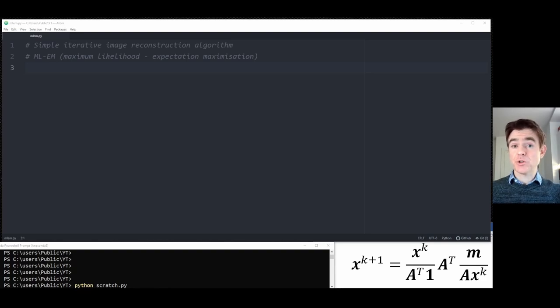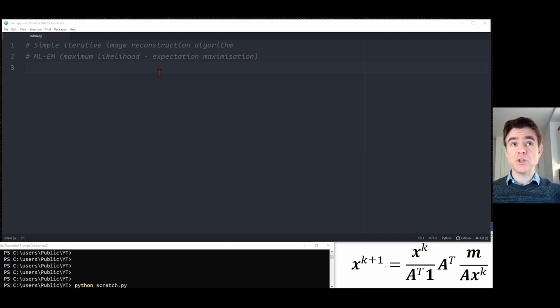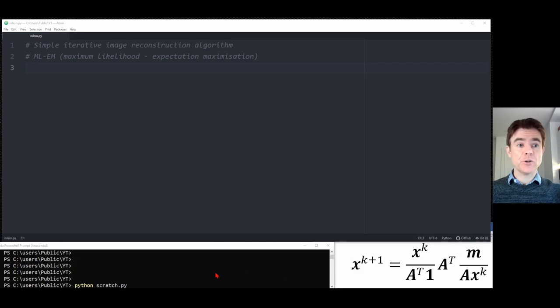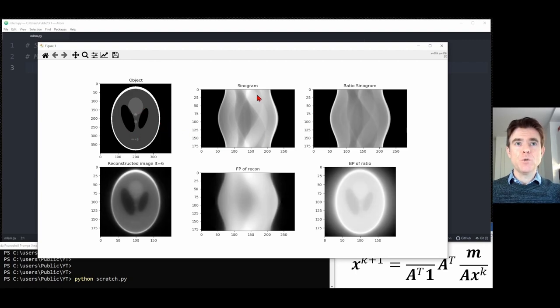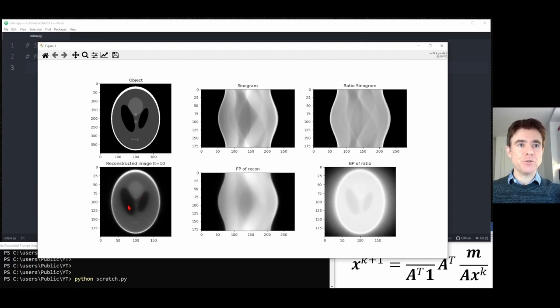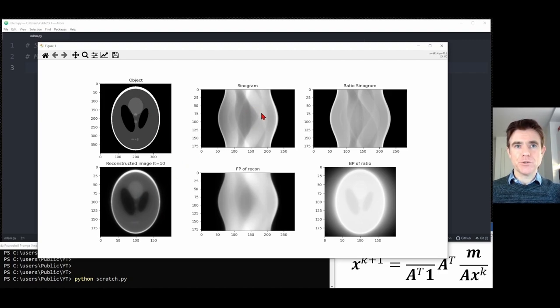In this video, I want to explain how to code up a very simple iterative image reconstruction method known as MLEM, or Maximum Likelihood Expectation Maximization. The equation is given in the bottom right-hand corner, and I'll talk you through it as we go along. What we'll be doing is creating a true test object — a phantom known as the Shepp-Logan phantom — creating a simulated sinogram, and then using only that sinogram, we will reconstruct the object iteratively, progressively looking more like the true object.